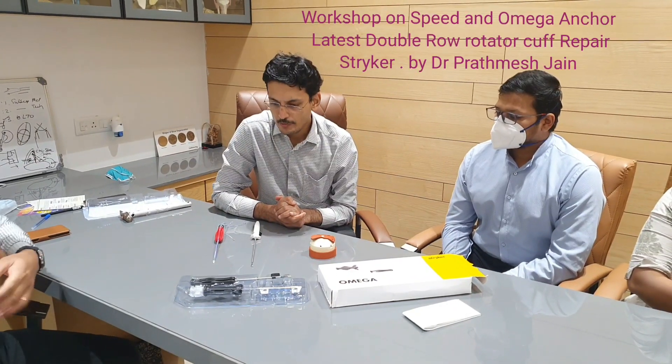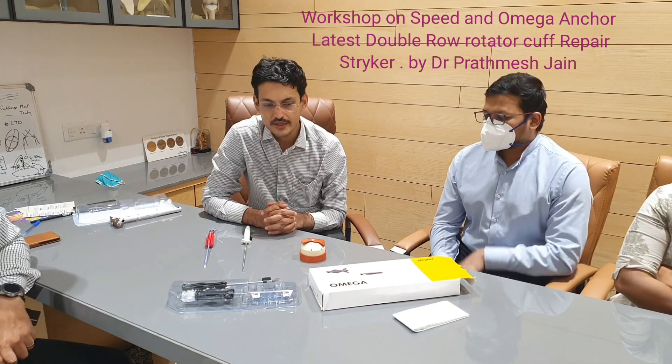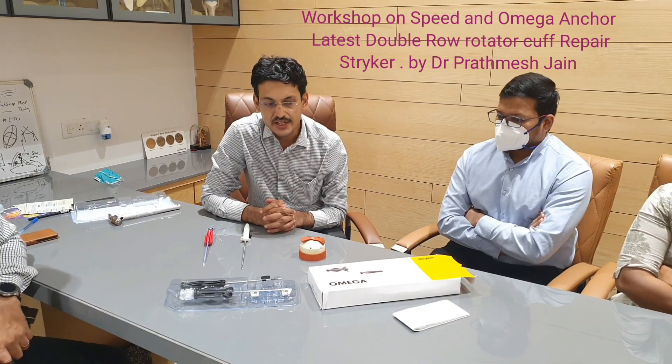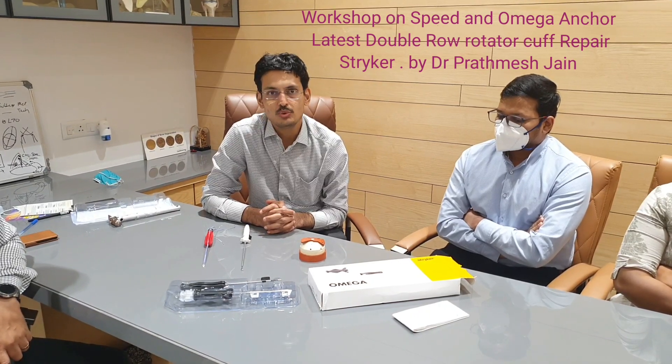Hello friends, today we will be discussing a new technique of rotator cuff repair using the Speed and Omega Nautilus fixation system. This is a very unique system.